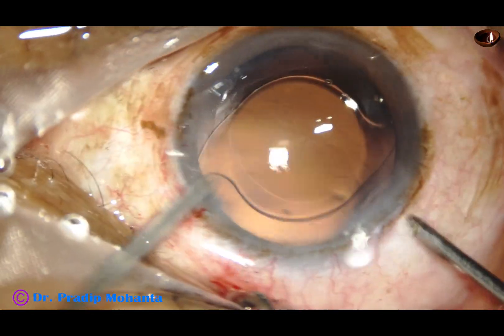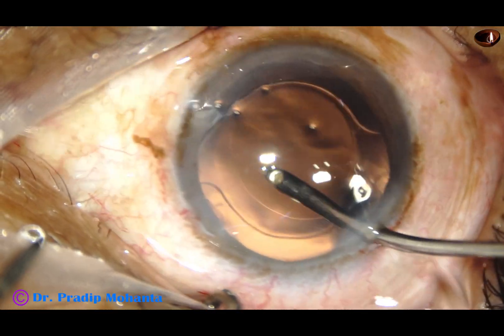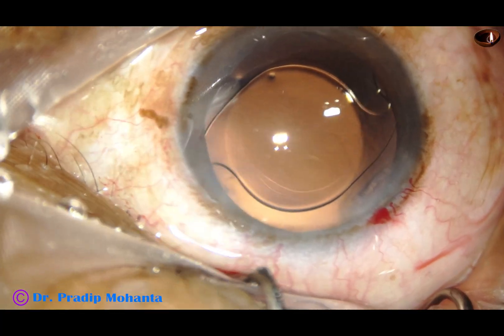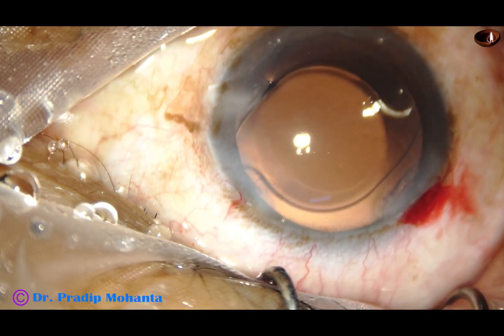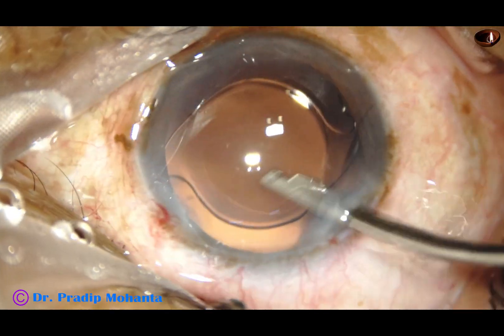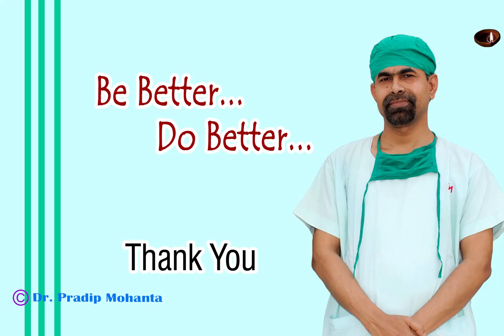So this is the technique. Hope you have understood the principles of pre-chopping. I do it in soft cataracts only. I try my submarine chop technique for hard cataracts. I don't try pre-chopping for hard cataracts, but you can watch videos of Dr. Pankaj Lande — he is a master in using an ultra-chopper for dividing hard cataracts. In this case, we are done. We have implanted the lens. The anterior chamber is nicely formed and the case is concluded. Thank you very much for your attention. Hope this video will inspire you to learn the use of pre-chopper, and I insist on learning this technique because it is safer than any other technique.